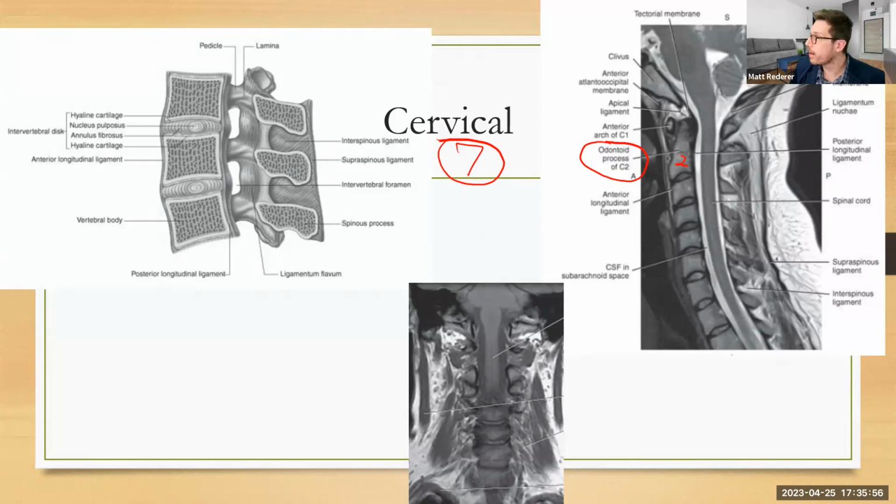It's hard to just pick one out of the hat and say, what vertebra is this? There's a bunch here and I don't know what's what. But if I can identify 2, I know that this one's 3, this one's 4, this one's 5, 6, 7. There's 7 cervical vertebrae, and I know the cervical spine ends here. T1 is over here, thoracic spine 1, thoracic spine 2, and so on. So this is the dividing line for the cervical and thoracic spine. If I can identify this arrowhead, I'm good to go. I could count this entire spine and make sure that I have it.